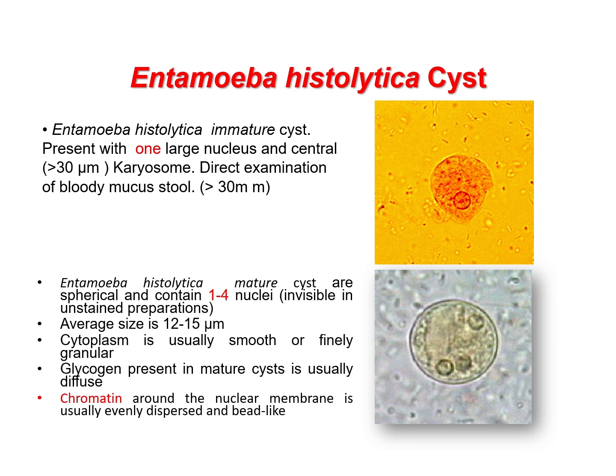Although I mentioned on my previous slide that trophozoites can be detected in freshly isolated stool of patients infected with Entamoeba histolytica, I want to emphasize that the more sure way of transmission of Entamoeba histolytica remains the cyst. So basically, when we diagnose a patient, we can see cysts in the stool, and these are the cysts that can infect new people through contaminated food or water.